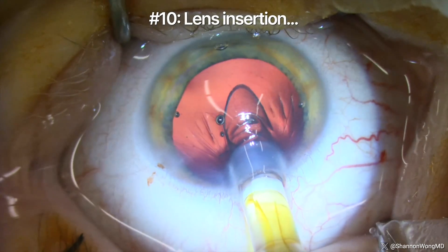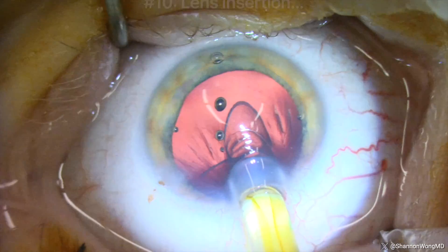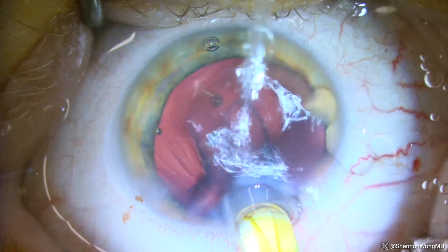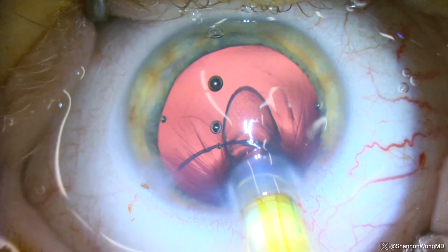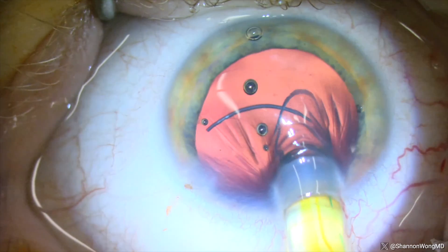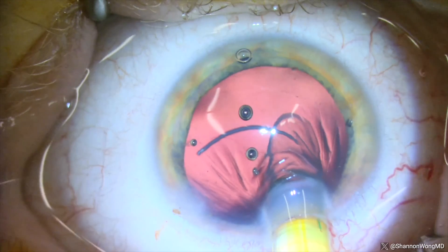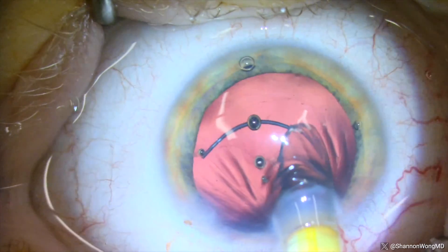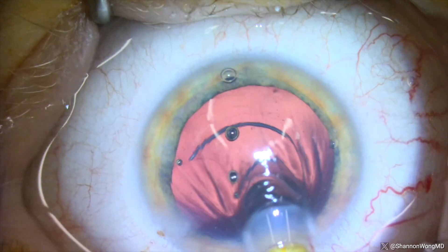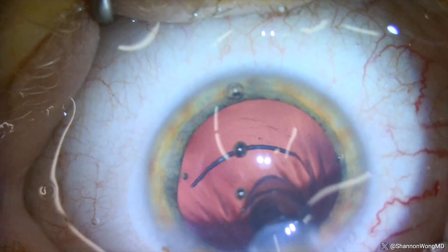Number ten: the lens is slowly inserted with the following steps. Make sure there is a full fill of viscoelastic in the anterior chamber. If the chamber shallows and the posterior capsule moves anteriorly during insertion, the leading haptic could break the posterior capsule. As the leading haptic enters the eye, the cartridge bevel is still downward, facing toward the posterior capsule. As the leading edge of the optic emerges from the tip of the cartridge, the leading haptic dives posteriorly.